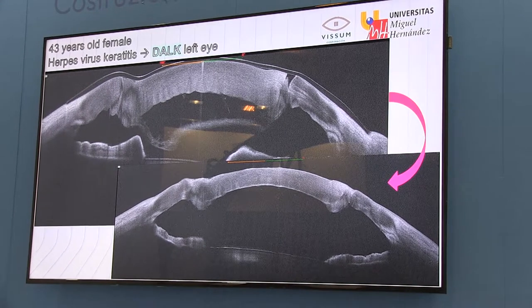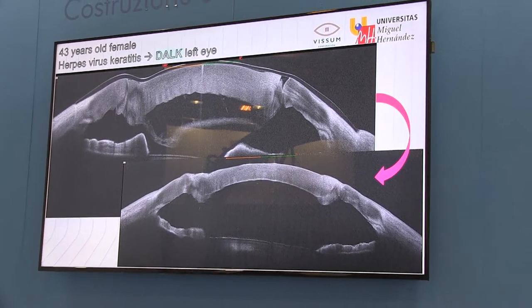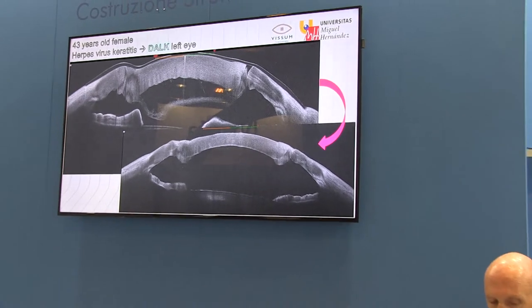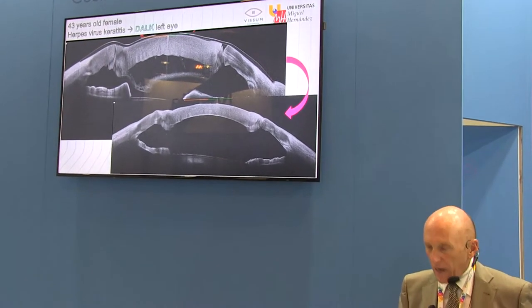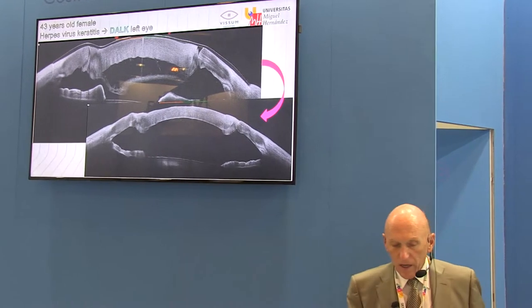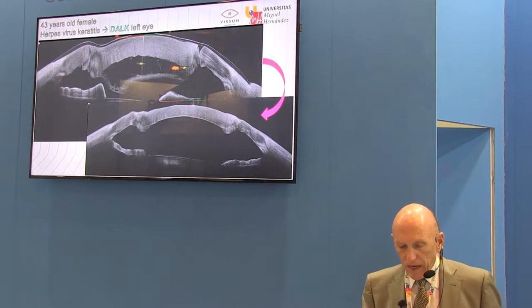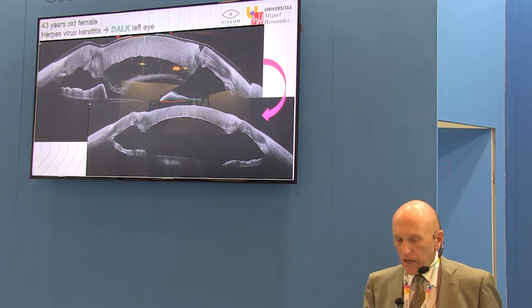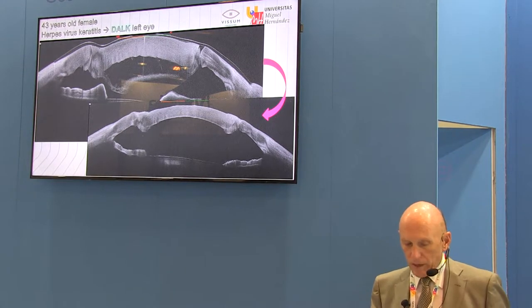The OCT was clear that there was a detachment. Sometimes you have moderate edema and you don't see whether you have a localized detached Descemet membrane, and sometimes it happens. This is a measured detachment, not visible at the slit lamp, but visible by OCT. The case was treated with bubbling and was resolved.